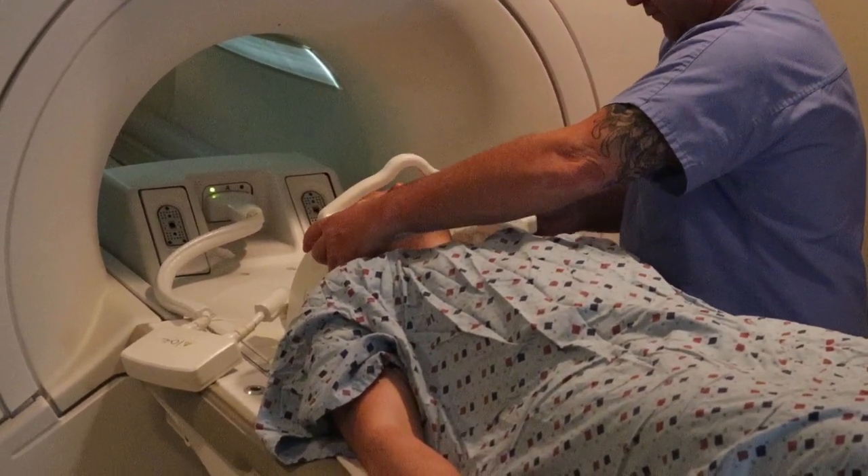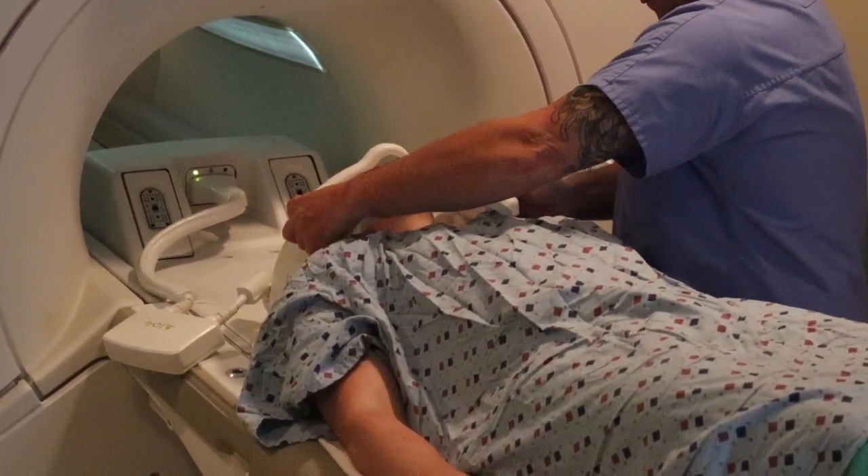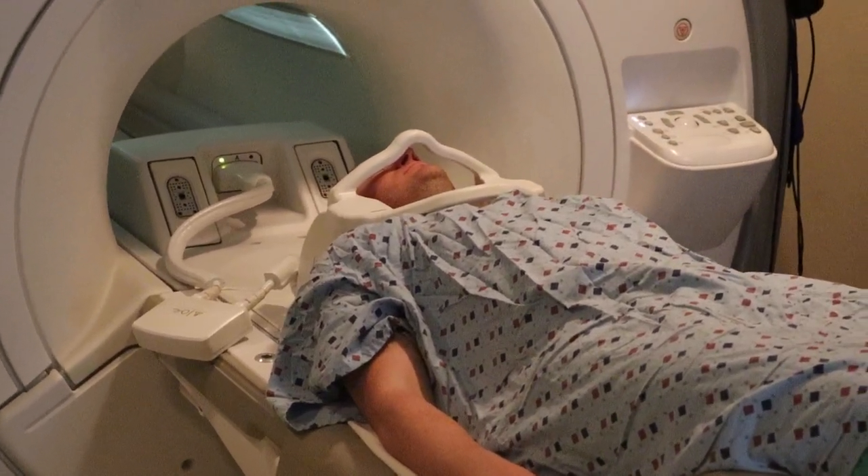You're going to fasten the anterior aspect of the cervical spine coil. That's going to activate and provide both posterior and anterior signal.